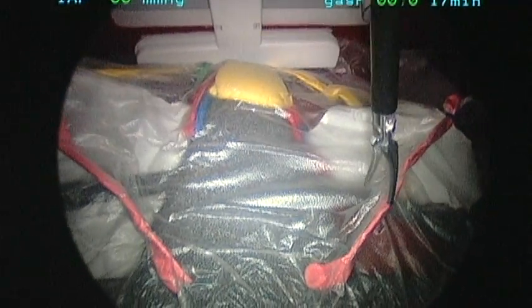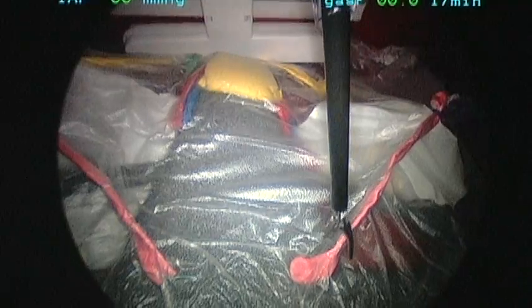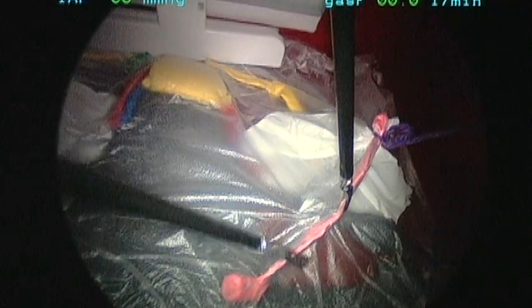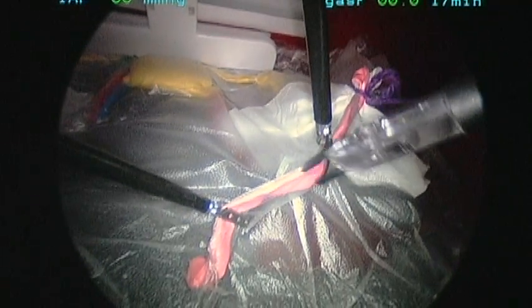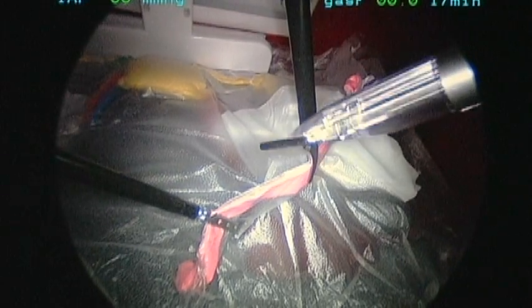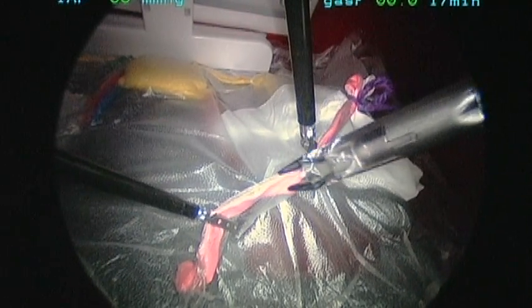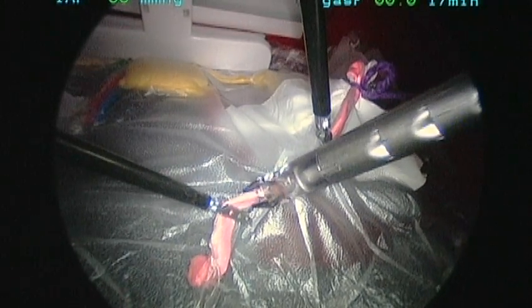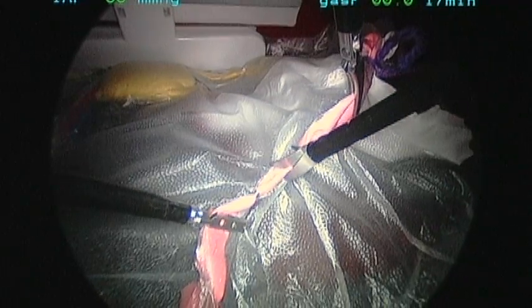To start the hysterectomy, we're going to do the same thing we would do in a regular case — we're going to transect the right round ligament. Grab here, you grab proximal. Since we don't have bipolar for this simulation, we're going to use clipping and cutting in places we would routinely need hemostasis. I'm going to cut in the middle.